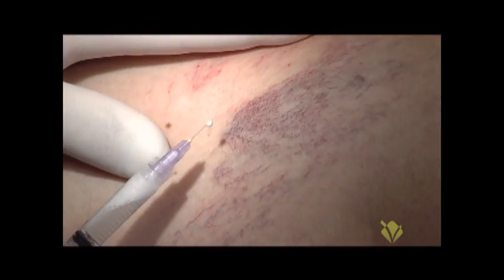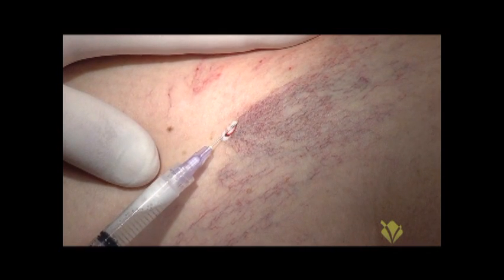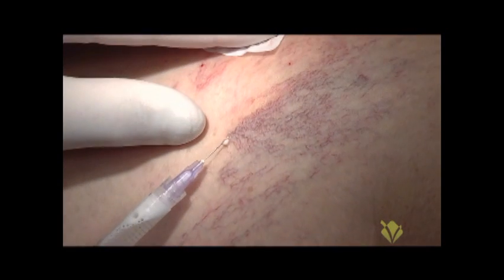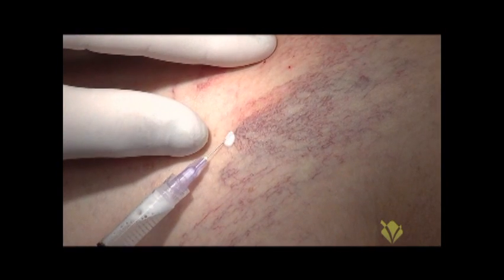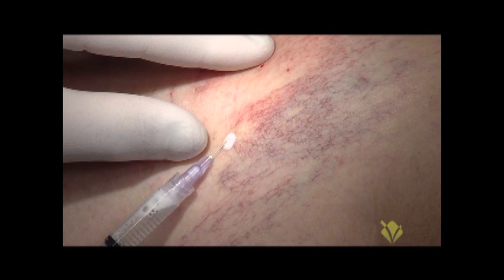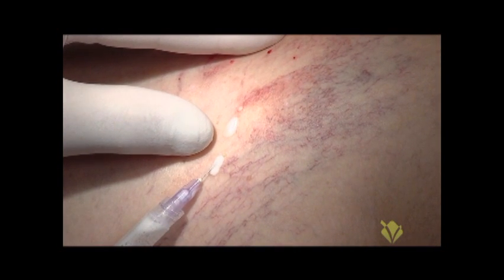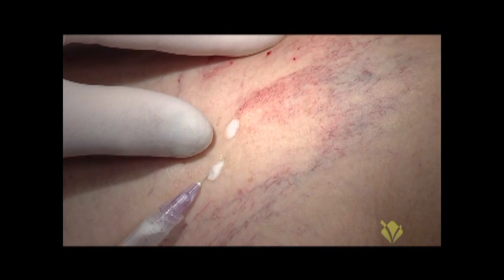I'll take my alcohol swipe and then gently move some of that medicine out towards the smaller veins, and then start with the next larger cluster next to it. Shelly, how you doing? You're doing fine. Watch the medicine. You're doing fine.